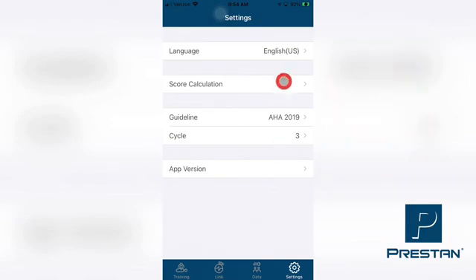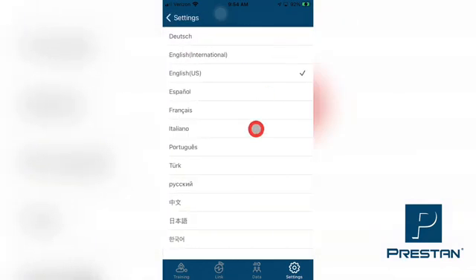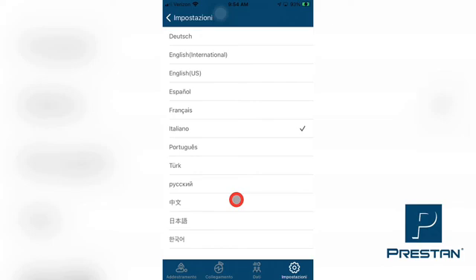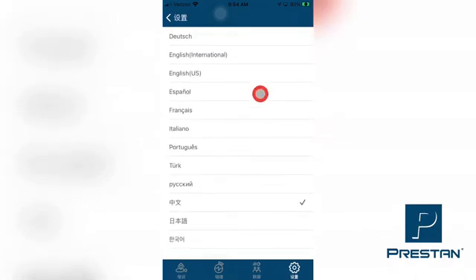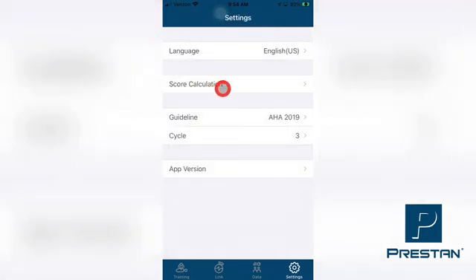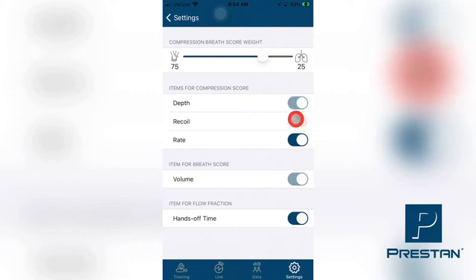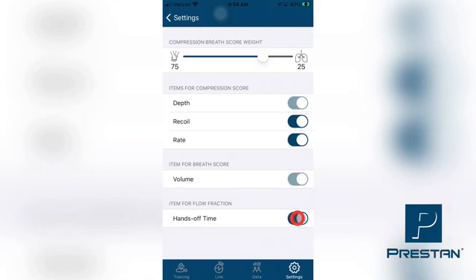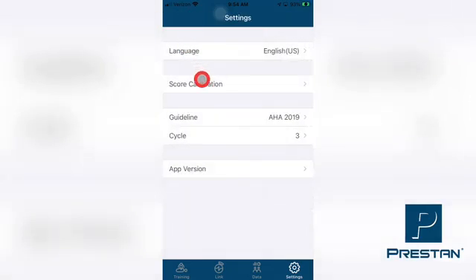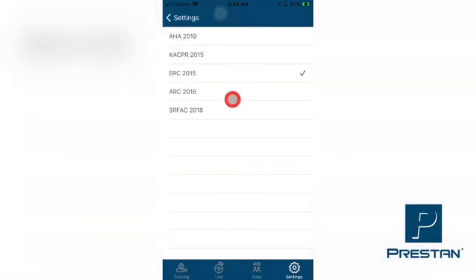The Settings tab allows for the managing and changing of the settings on the Preston CPR Feedback App. These settings include changing the language and the measurement units used for the specific region in which the training is being performed, and managing how the overall scores are to be calculated.